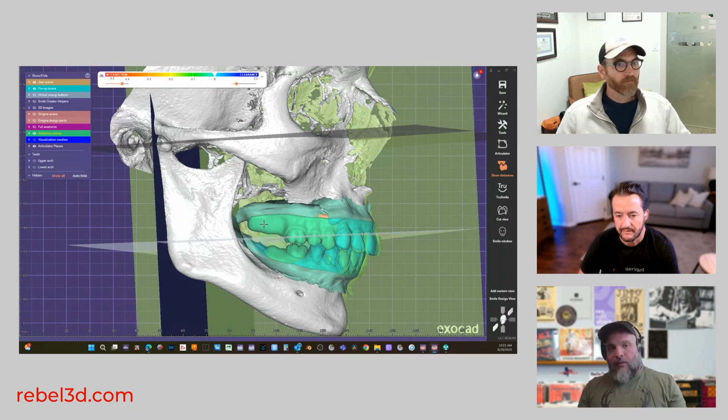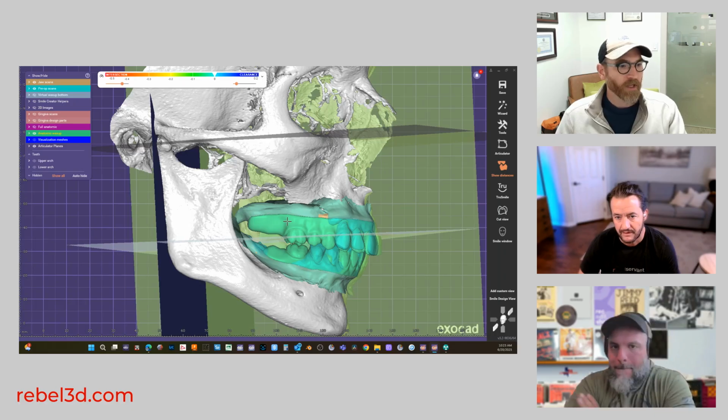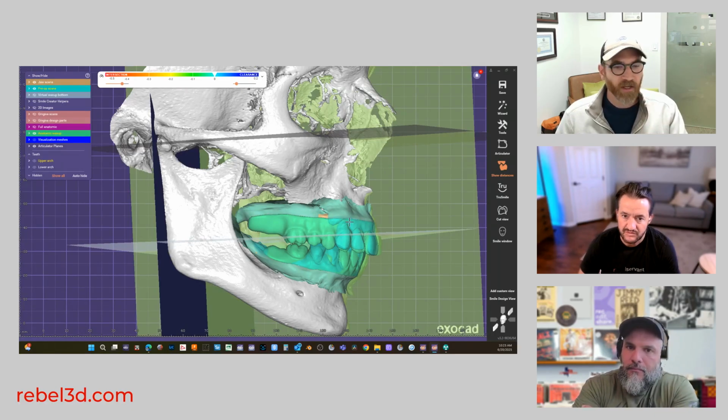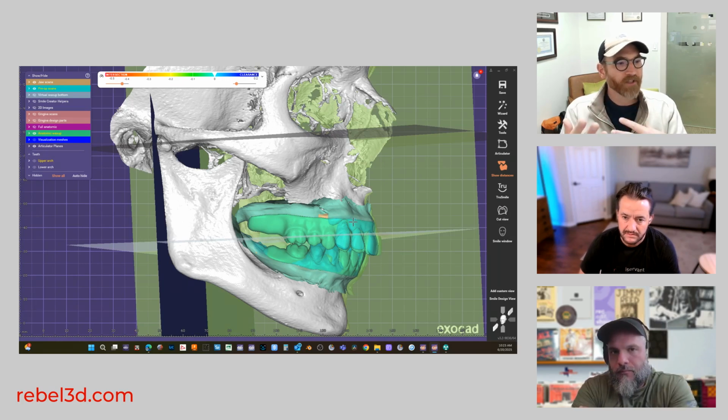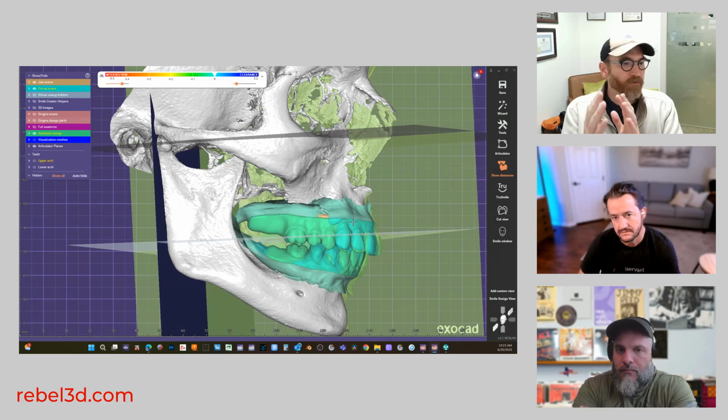So it's awesome what Dr. Sven is doing. Yeah. Thank you. And we find that too: the clearer the instructions are, like with lip biting or cheek biting, the more information I can give you, Daniel, the more power you have, right?